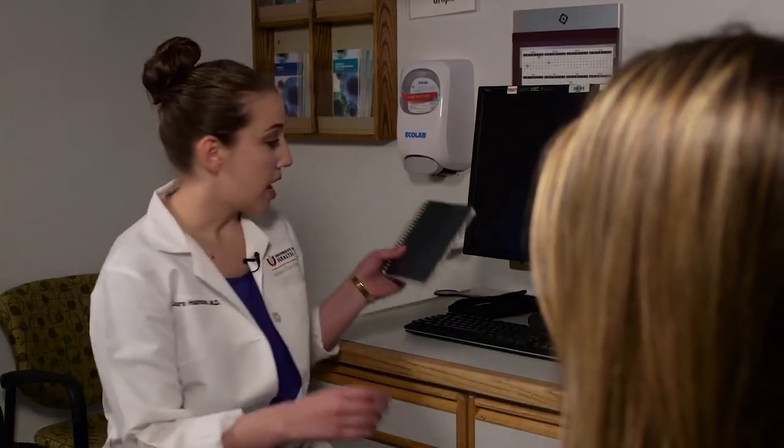Today we're going to be showing you some of the features of the neuro-ophthalmic exam. We're going to start today with the Hardy-Rand-Rittler pseudo-isochromatic color plates. This is one way that you can test color vision. The nice thing about these plates is that they can screen for red-green defects and for blue-yellow defects. The Ishihara color plates primarily just screen for red-green defects.